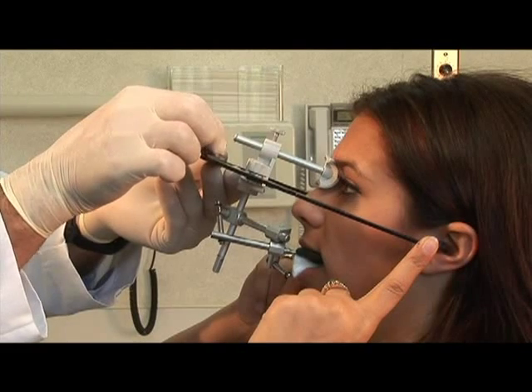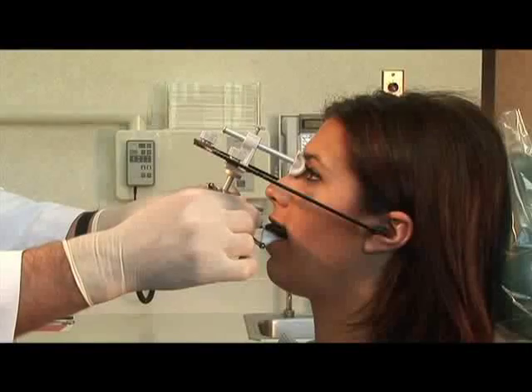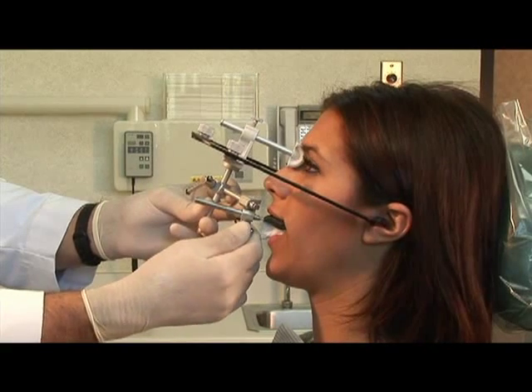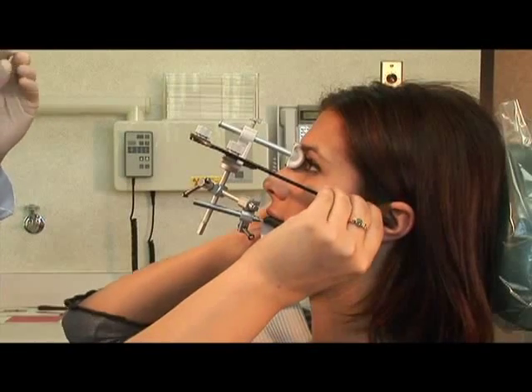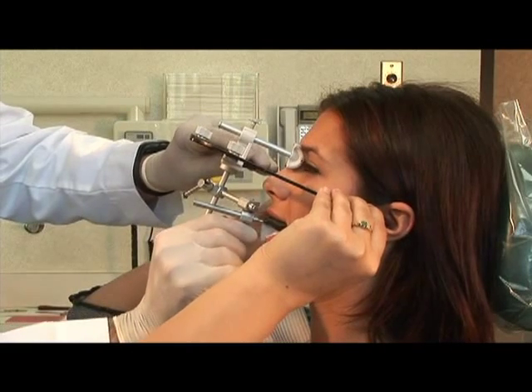Okay, hold on to it there just like that. Once the facebow is in place, gently tighten the toggle, taking care not to tilt the facebow. Next, have the patient gently hold the facebow arms to stabilize it as you finish tightening the toggle. Here we have the completed facebow transfer. Note that the facebow is centered on the patient's face and the transverse bar is parallel with the interpupillary line.